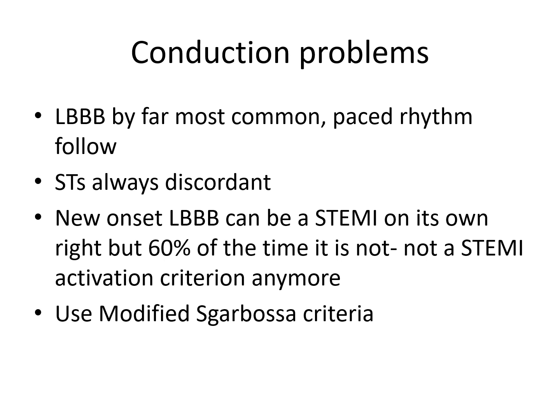So conduction problems will create this issue of identifying accurately ST elevations. And in clinical practice, I would say that a left bundle is by far the most common reason, with paced rhythm being a distant second. In those conditions, the ST is always discordant, and in the precordial leads, which are negative, the ST segment will be elevated. Now, in the previous iterations of the American Heart Association guidelines, a new left bundle in the presence of chest pain was assumed to be a STEMI.